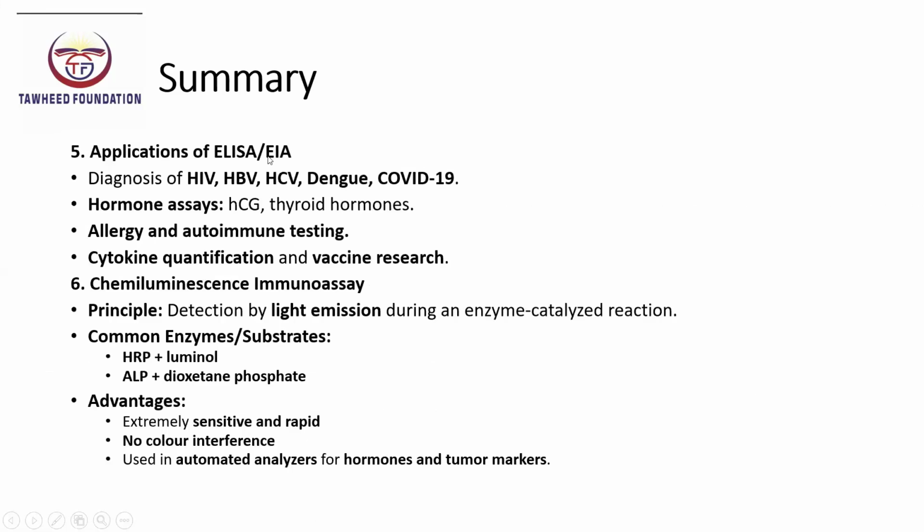ELISA is safe, economical, and ideal for mass screening of diseases like HIV, HBV, HCV, dengue, and COVID-19. Other applications include hormone assays, allergy and autoimmune testing, cytokine quantification, and vaccine research.